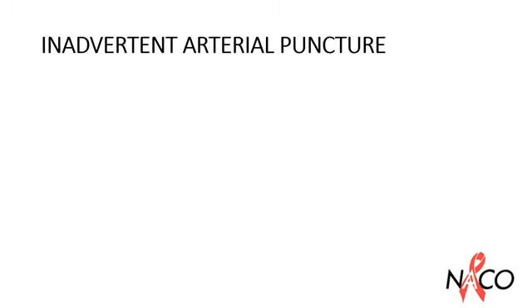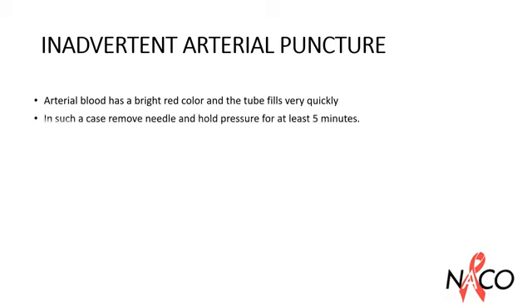Sometimes during phlebotomy, there can be an inadvertent arterial puncture. Arterial blood has a bright red color and the tube fills very quickly. In such case, remove the needle and hold pressure for at least 5 minutes.